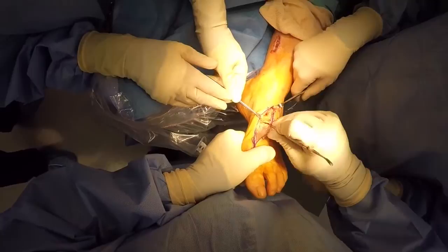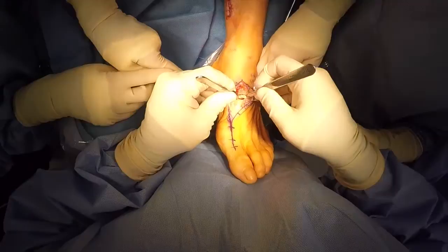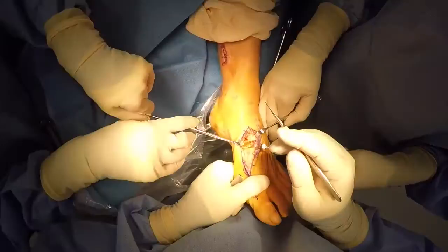So here we are utilizing a freer elevator. You may also use an osteotome or other instrument to free up the cut surfaces of bone. The most difficulty with this procedure, as you can see here, is typically with the plantar lateral aspect of the base of the first metatarsal. This is the insertion of the peroneus longus tendon on the plantar lateral aspect of the metatarsal, and it's typically the most difficult part of the bone to remove.